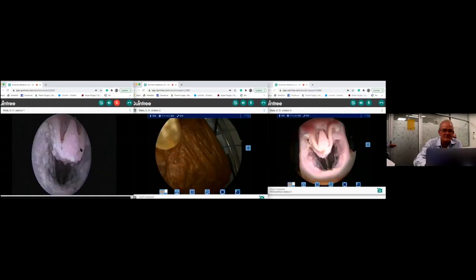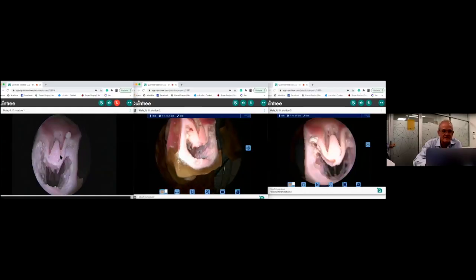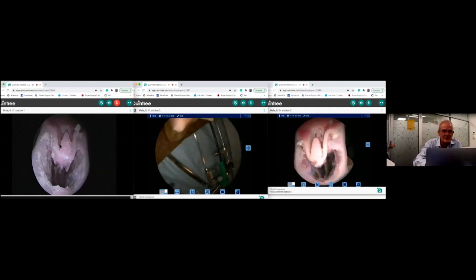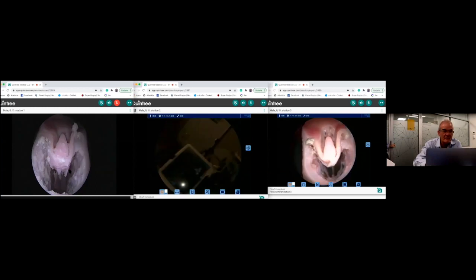And there's a space. If you look at station one, look at the frontal T. You see how the T pushes forward and how we've lowered the frontal T.